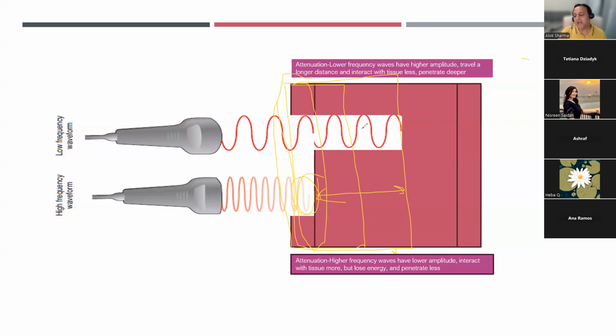Now, when I talk about the protocol tomorrow, what I will tell you is that we tend to start with a frequency of 8 to 9 in term babies. And in preterm babies, we normally use frequencies anywhere between 12 and 18 in the literature. Every author has slightly different ways of doing it. And experience says that the more preterm the baby, the higher the frequency.